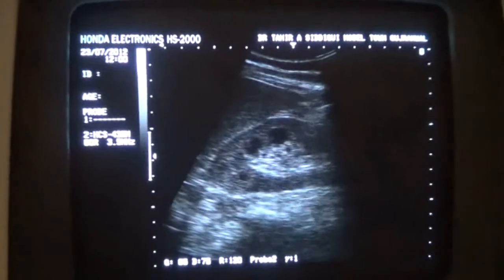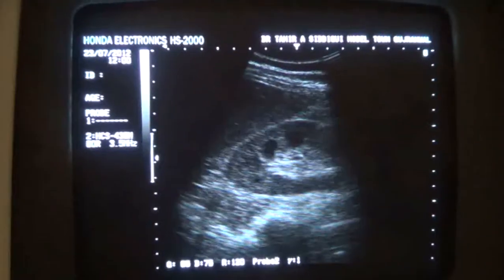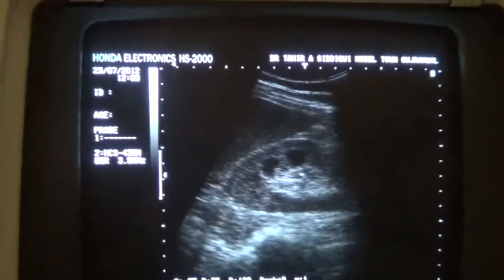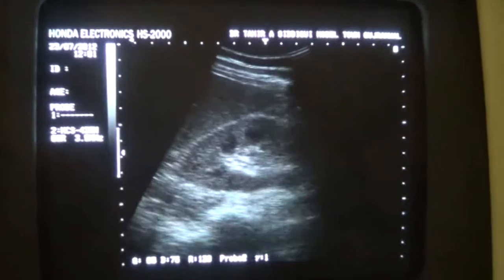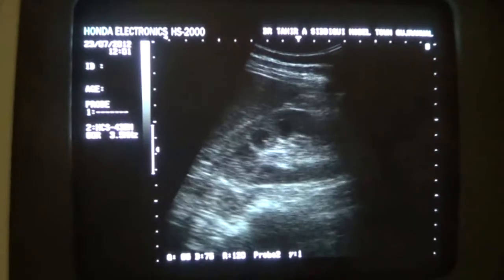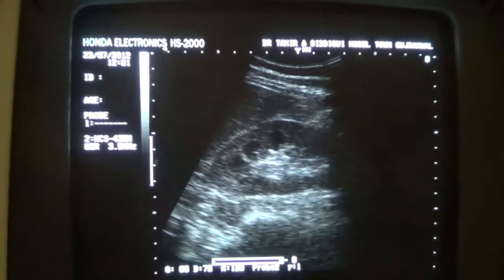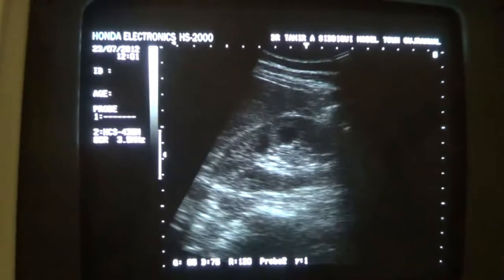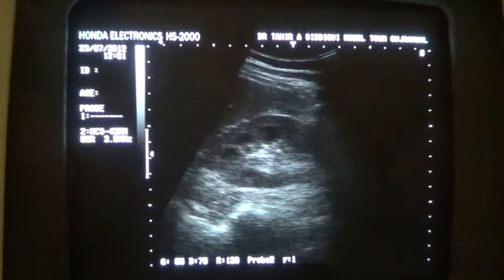The main purpose to show you the kidney in this patient is to make you see the prominence of the renal pyramids, also called medullary pyramids.